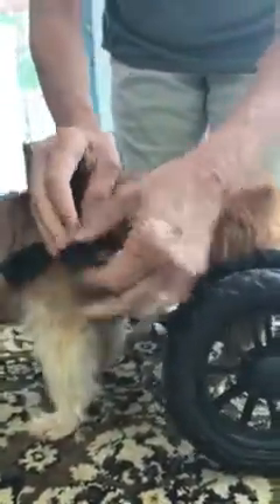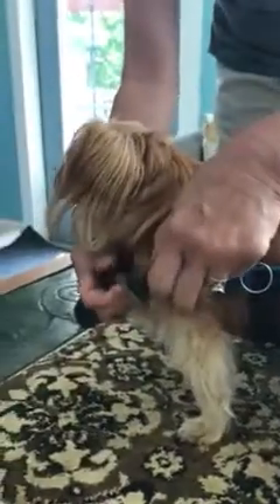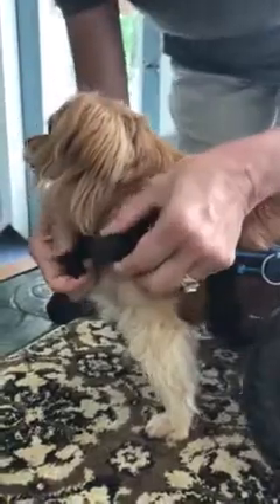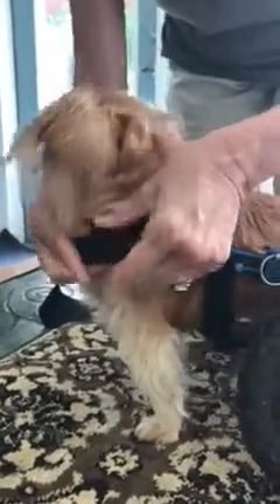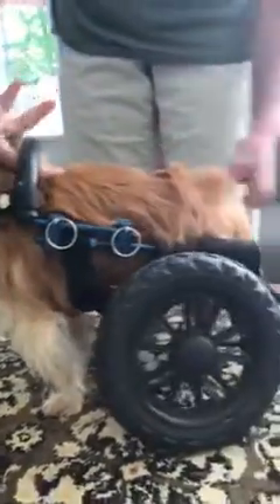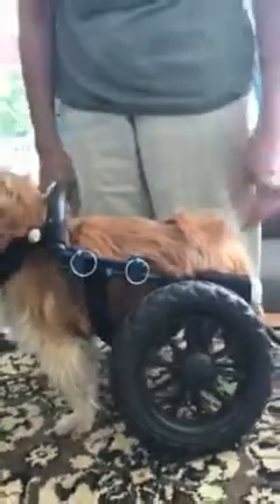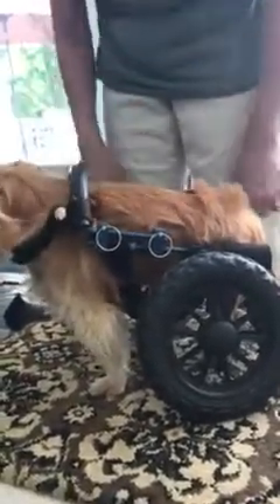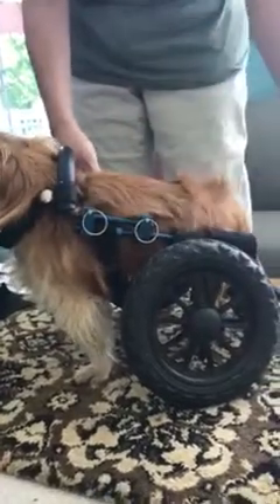I'm putting the pull pins in and buckling the chest strap. You can see the yoke is about an inch above his shoulder blades, the chest strap is on his throat which is very uncomfortable, and the side rails aren't level.